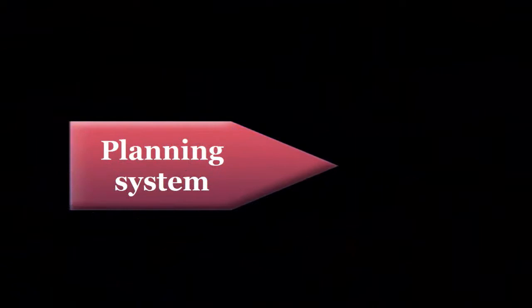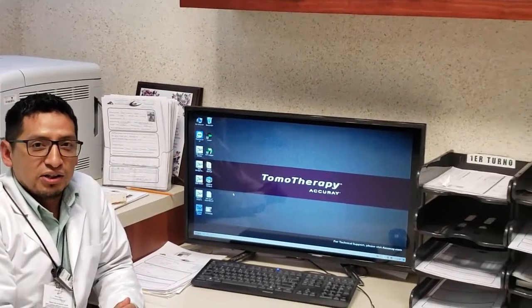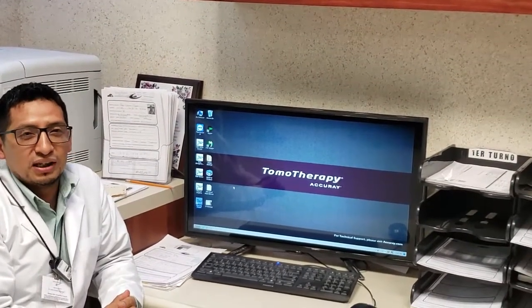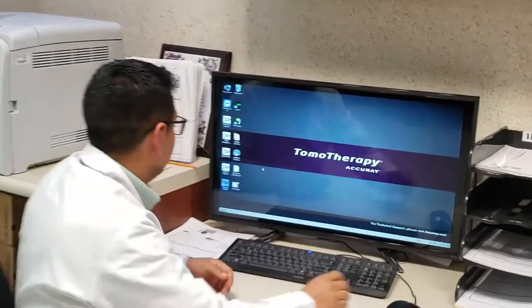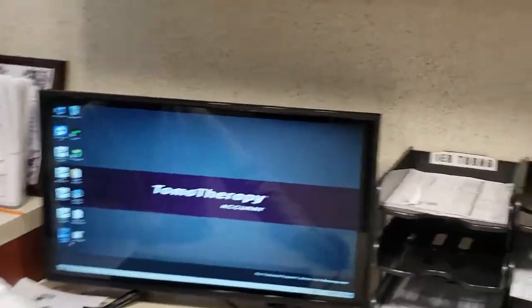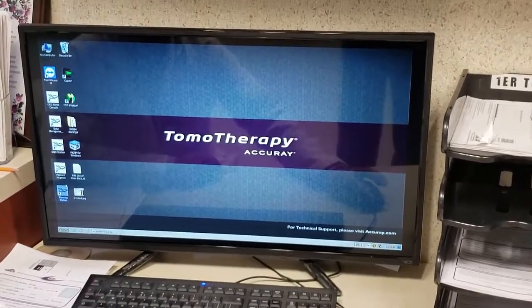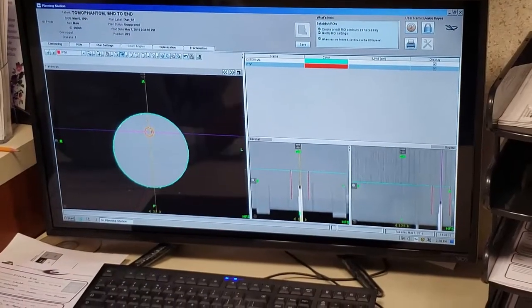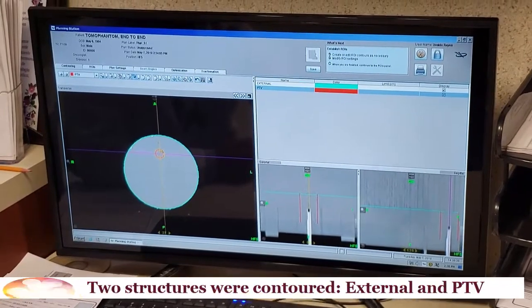Planning system. We are in the planning station. Now, what we are going to do is download our patient. For this, we open the planning software.